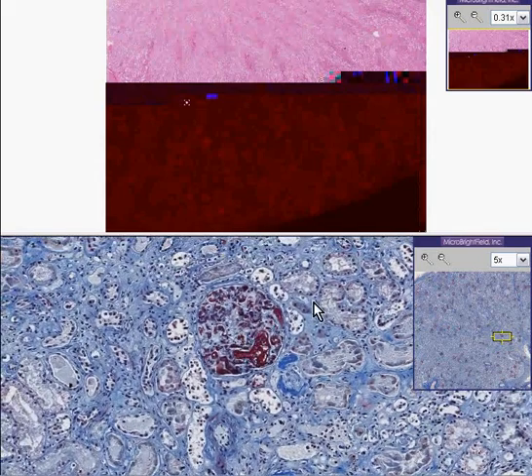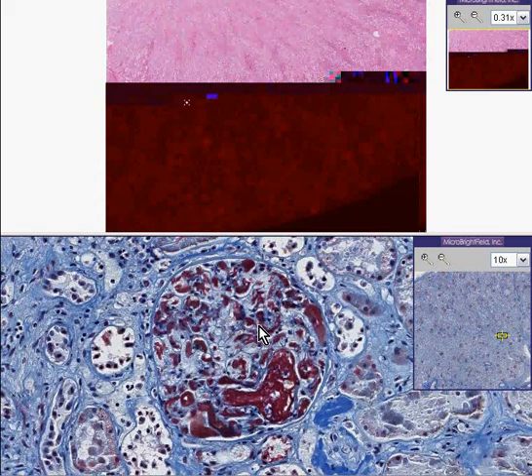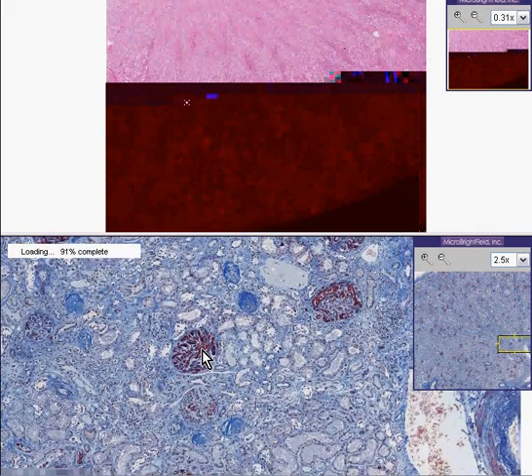They are filled with fibrin because this is a DIC case, and basically many small vessels in the body are forming clots. This is also called a consumption coagulopathy because it consumes fibrinogen and platelets. And this is a pretty striking example as to why those glomeruli look congested. It's not congestion, it's actually small thrombi within the glomerular blood vessels.